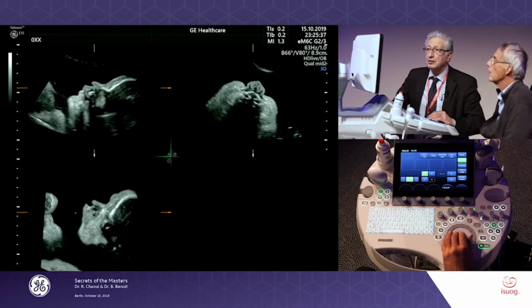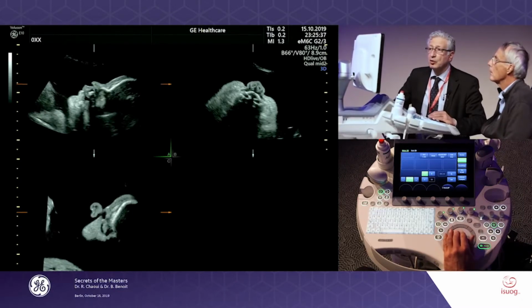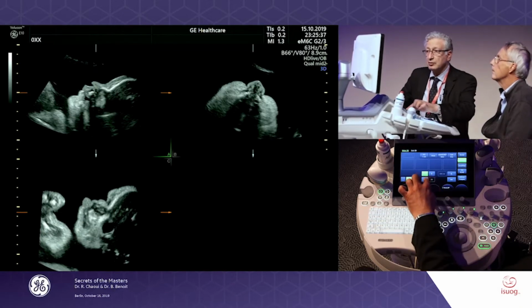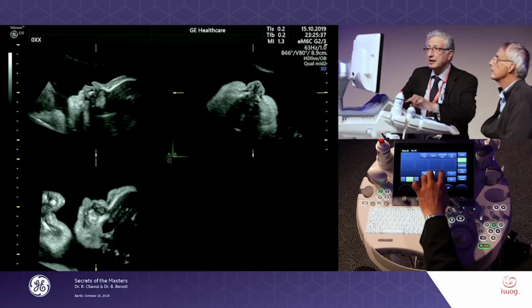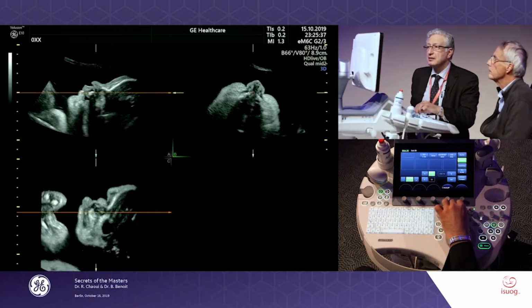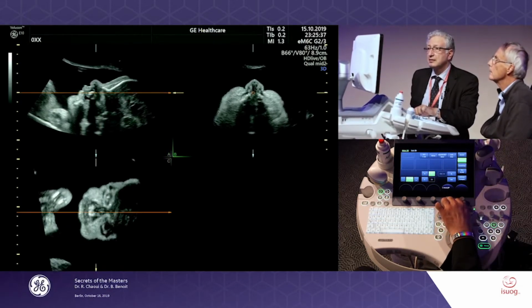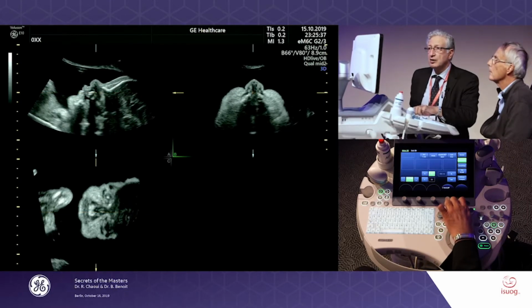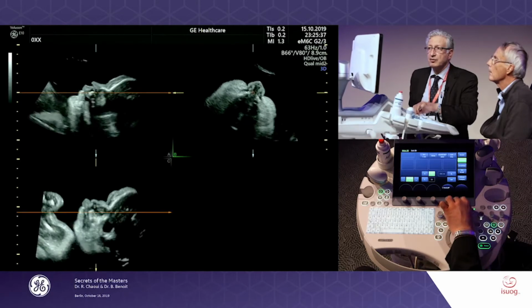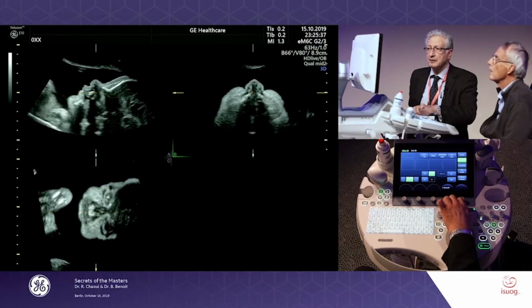I choose the A plane and put the dot on, let's say, the tip of the nose, a little bit lower. Then I will move to the B plane and rotate the whole around the Z-axis. And you see how the so-called thickness is changing, because if you take it obliquely, it's different.